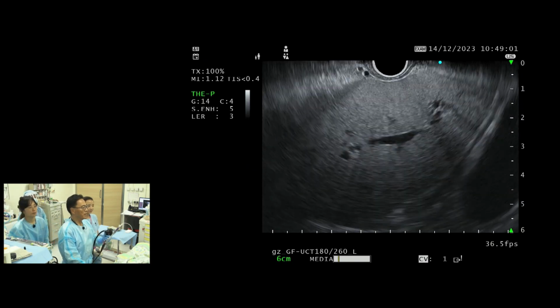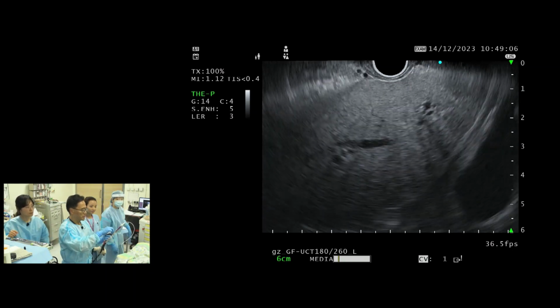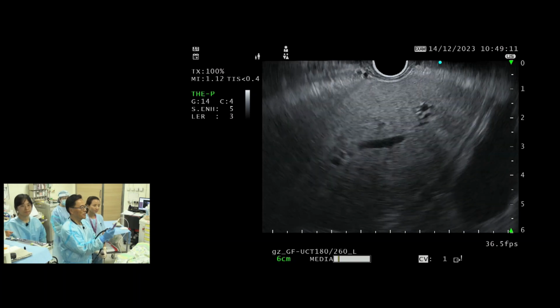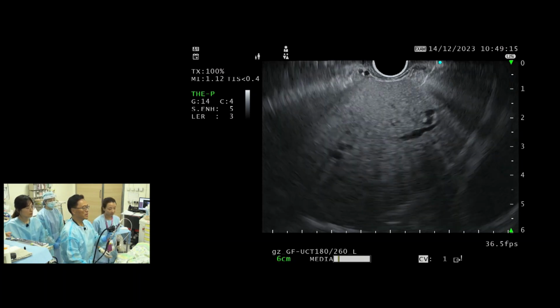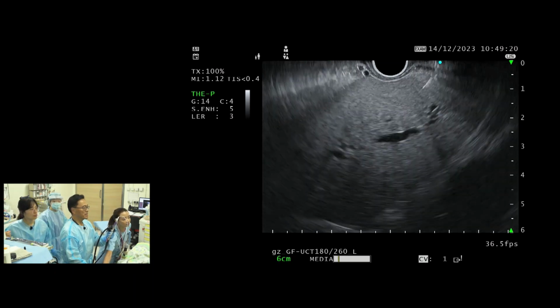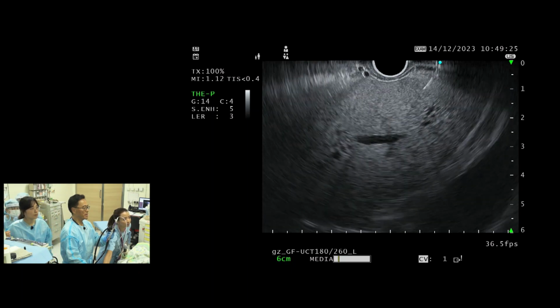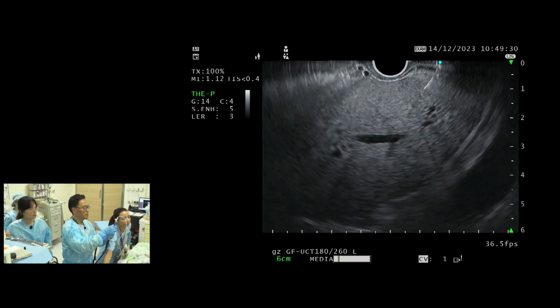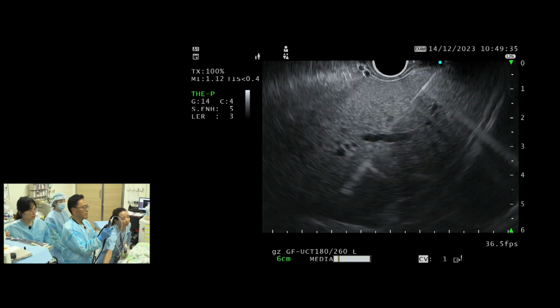All right. So now I'm ready to look at my trajectory. Just like with any FNA, you want to line up the needle with the target. My technique is actually through and through. I'm going to go through the vessel and then pull back to get it into the center. So I'm going to do a fast movement. I'm going to let her breathe and then go. And now I'm going to move back.